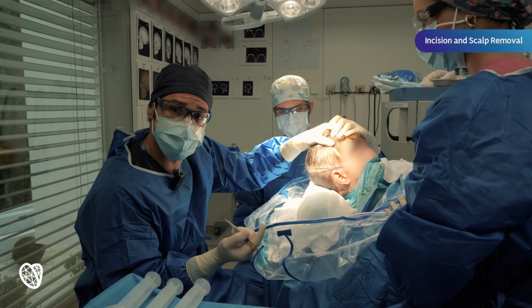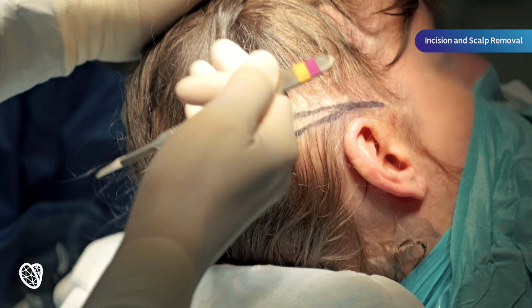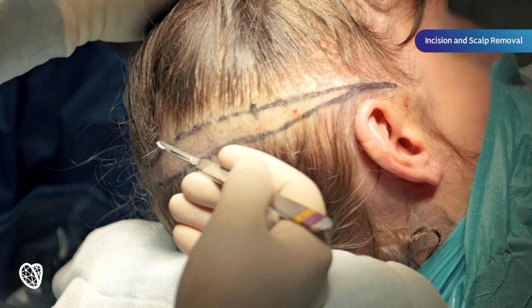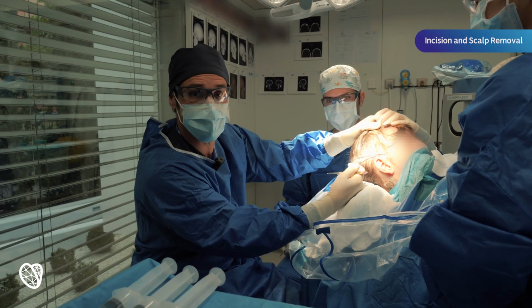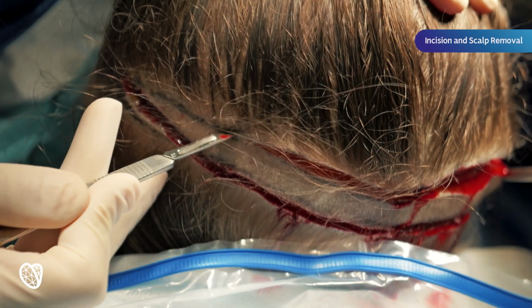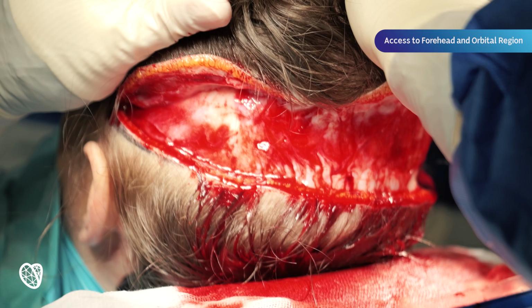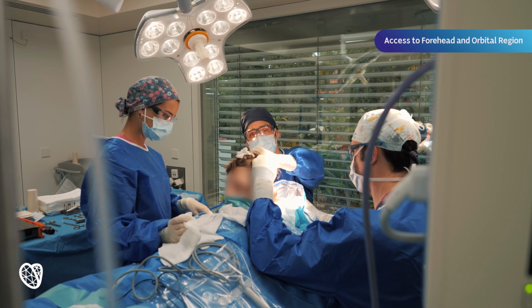During the preparation of the case, we have made the incision, in this case a very posterior incision. Why? Because it's the ideal way to hide the potential future scar. Here is the strip that we are going to remove, and from here we will arrive to the forehead region. Once the strip has been removed, now we have to detach everything until we arrive at the region where the forehead will be recontoured.